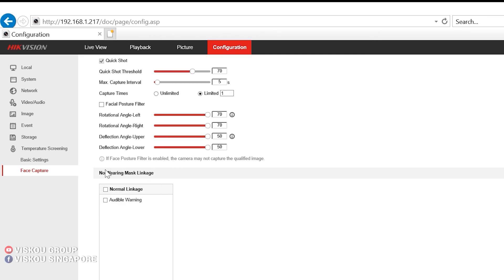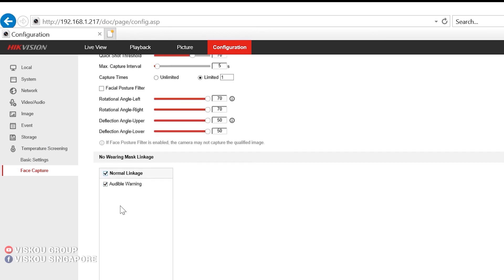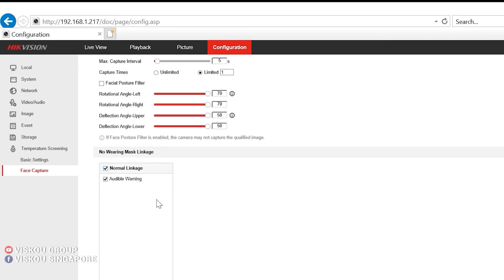So if someone is not wearing a mask, you can set it to alert you. You can just check it, normal linkage, audible warning. So when you detect that someone is not wearing a mask, you will get the audible warning also. It will tell the person to wear a mask. Then you click save.